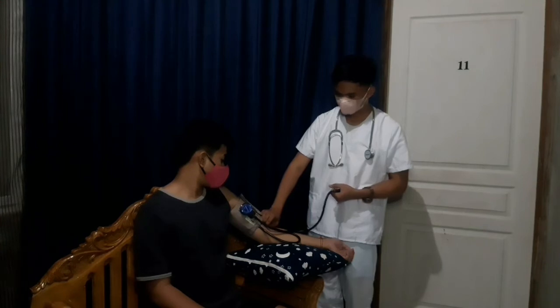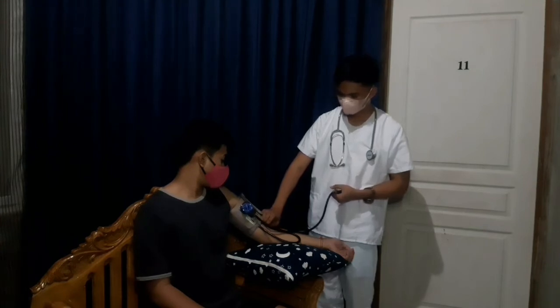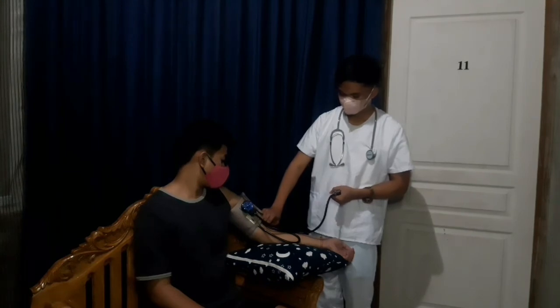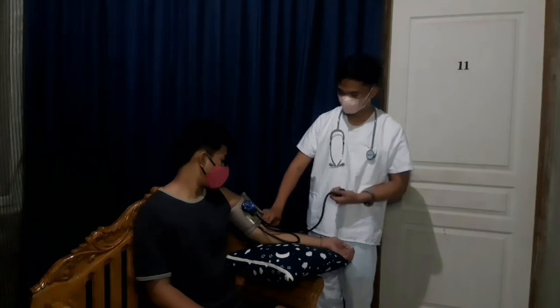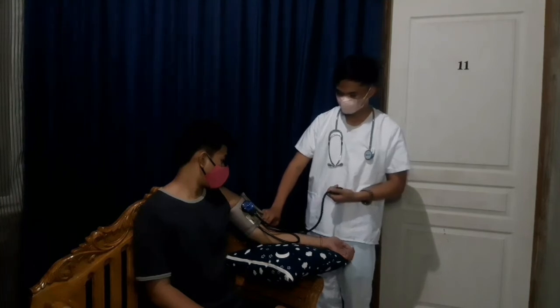At that pressure, the blood cannot flow through the artery. Note the pressure on the sphygmomanometer at which the pulse is no longer felt. Release the pressure completely in the cuff and wait one to two minutes before making further measurements.